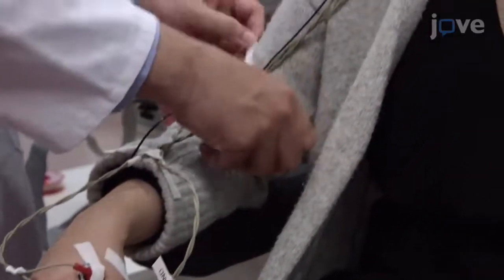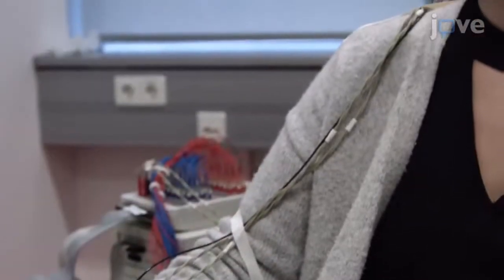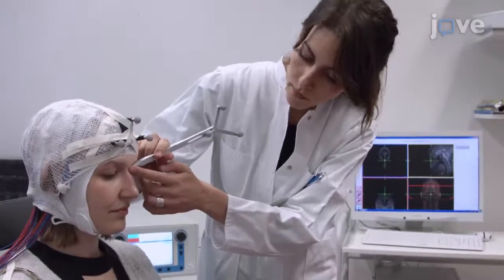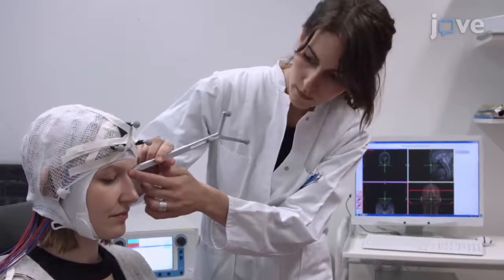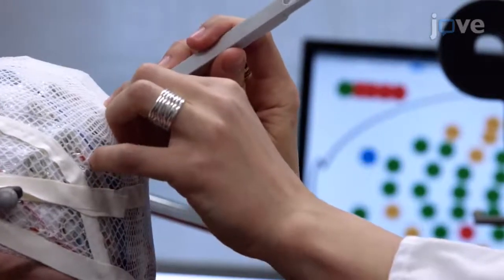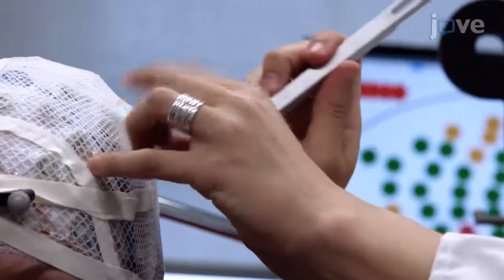Keep the bipolar EMG cables close together and close to the body of the study participant to reduce line noise pickup. Then use the pointer tool to co-register the head model with the relevant anatomical landmarks and pinpoint the EEG sensor locations to enable the subsequent estimation of the individual sources of the EEG activity.